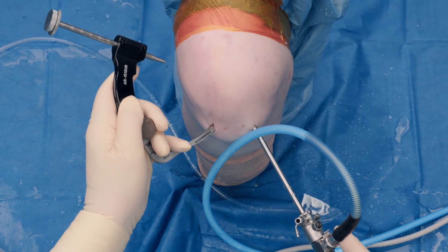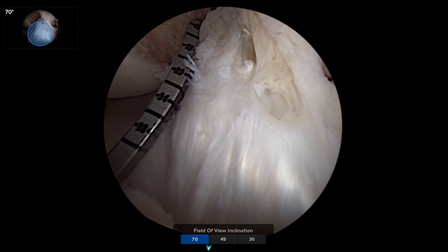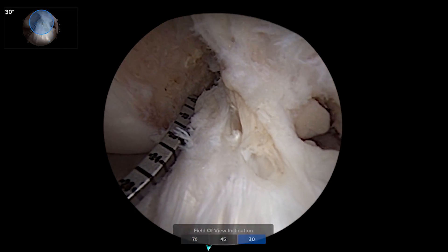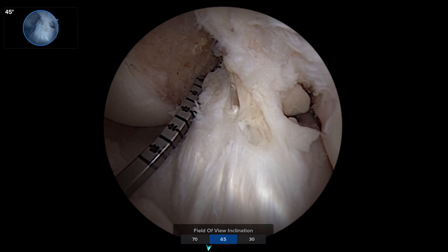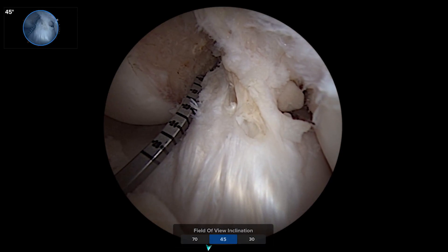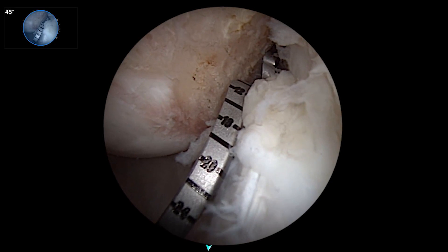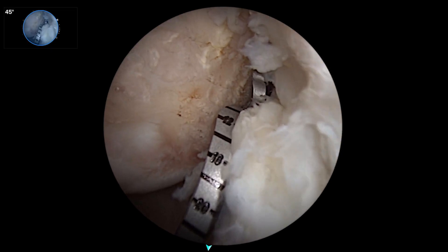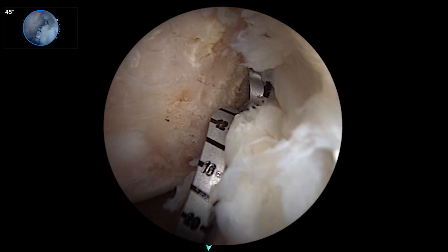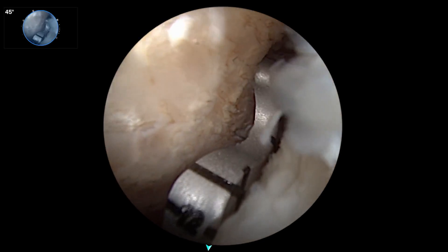I've prepared this like I'd be doing a repair from a proximal avulsion. Looking down at 70, then 30, and then this is the panoramic or 140-degree wide-angle view. I have our six-to-nine guide into the anterolateral portal, and this is a very difficult place to see and position your guide pin for passing the button part of your repair and tightrope later.